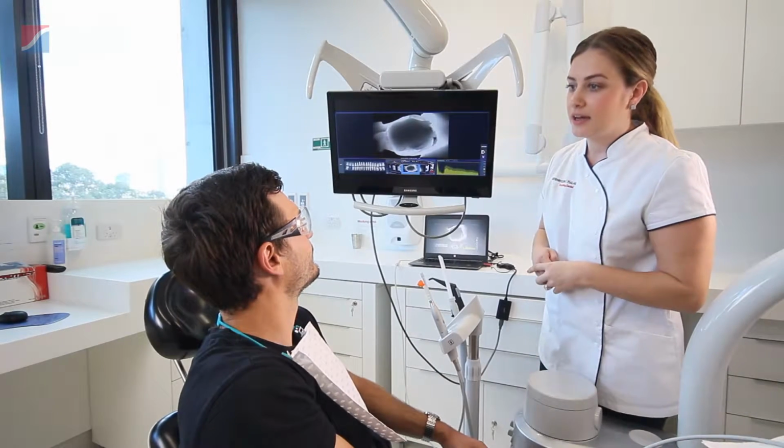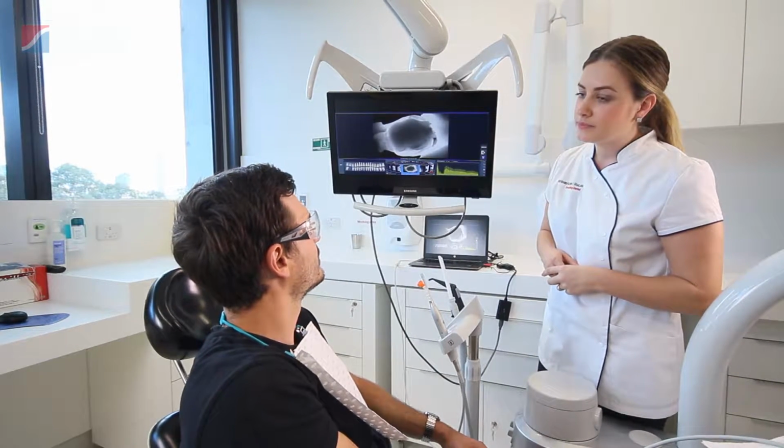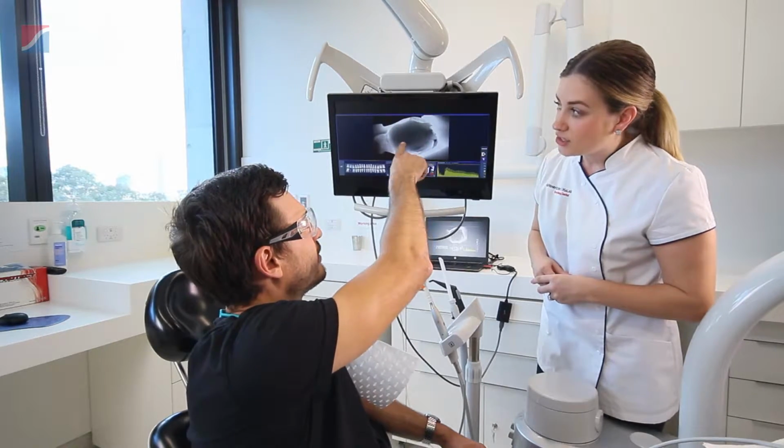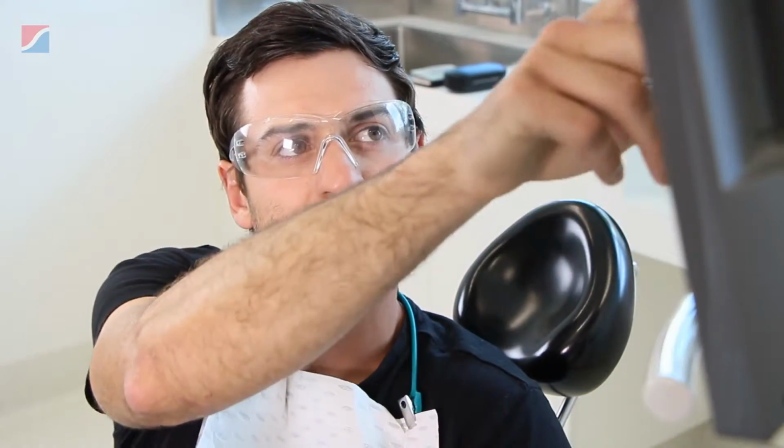Essentially, because it's such an easy method for patients to be able to relate to, they point to an area of concern and then can co-diagnose the image for you. It's extremely powerful for patients to be able to do that and gives them the visual confirmation they need to then go forth with the treatment plan that you have set out.